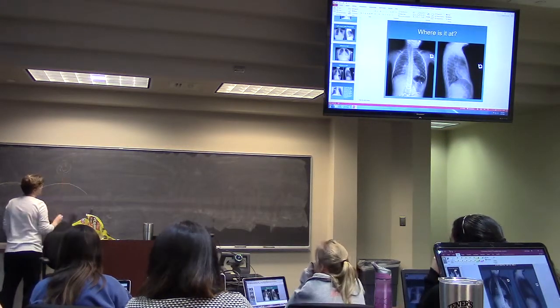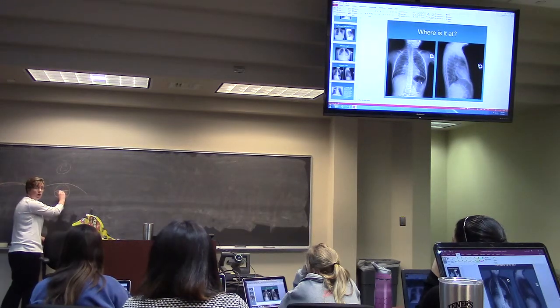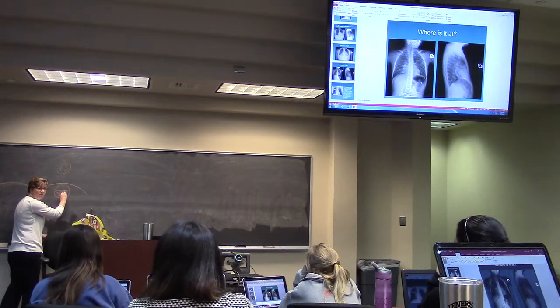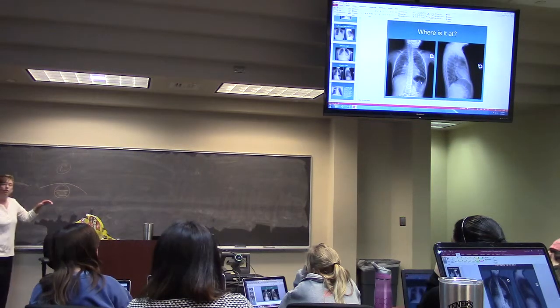Versus, like even on this side, so this is your left side, right? Correct, left side. A gastric air bubble looks like an air fluid level. You have fluid, and then you have air. So this is denser, right? Opacity. And then you have air in this spot right here, so it looks black. So that's the air fluid level.